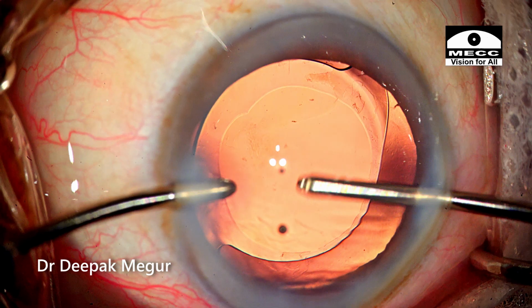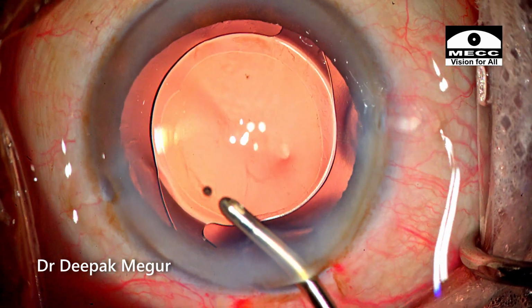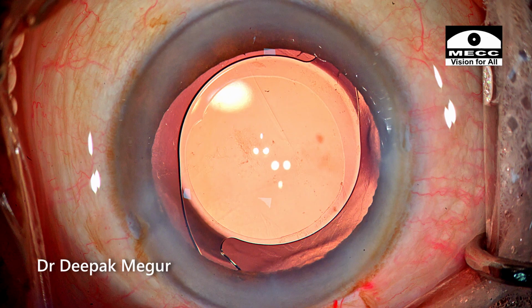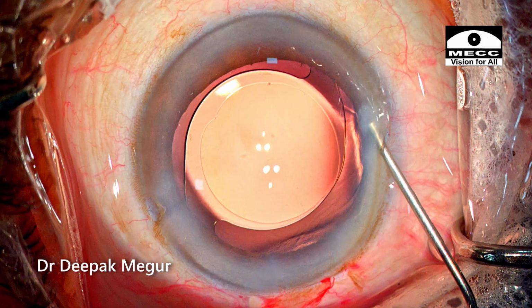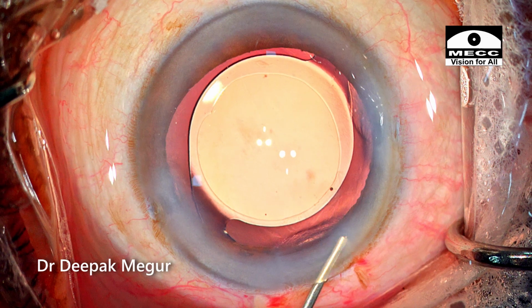In the beginning I was aiming at a 5.5 mm rhexis. It has turned out to be quite well centered and appropriately sized. So we have a rim of rhexis covering 360 degrees of the optic of the lens. When doing hydration, care is taken that the direction of the tip is more anterior to prevent any accidental Descemet membrane detachment.